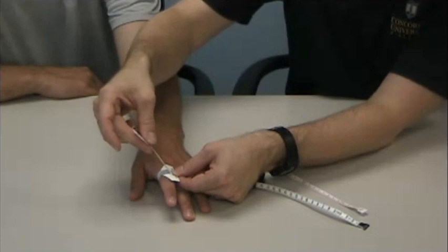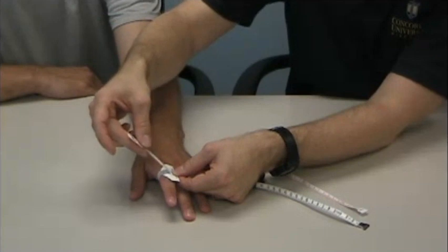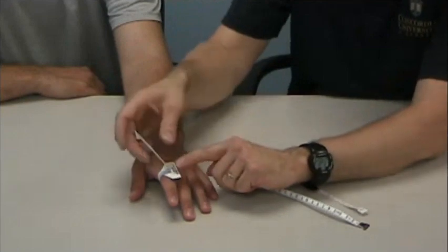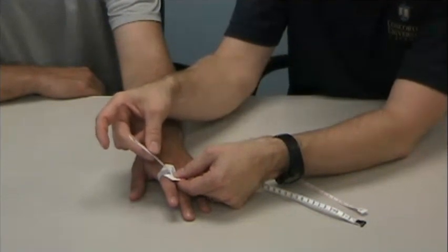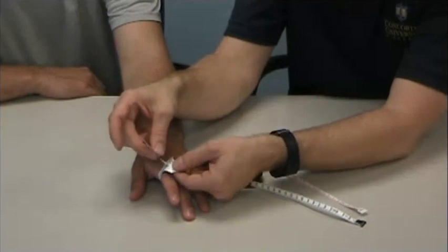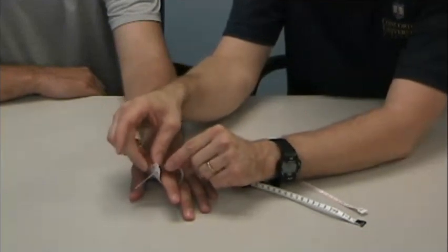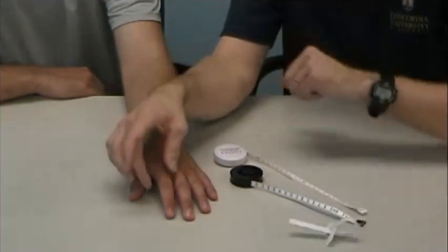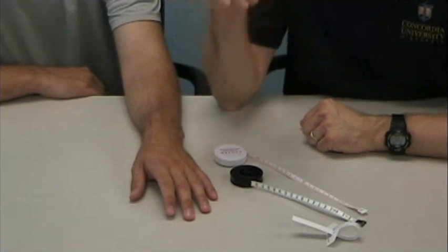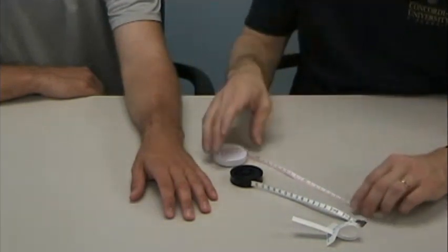One thing you have to be aware of is it doesn't show you the centimeter number that you are actually measuring. It shows you the next one up because the one you're measuring is underneath this little tab. But in this case, this would be about 6.3 centimeters in circumference at the proximal phalanx. When you report that, you are going to report the measurement and also exactly where it was measured—is it the proximal phalanx, the PIP joint—so that you can replicate it the next time.